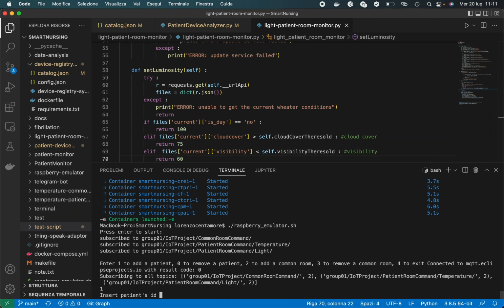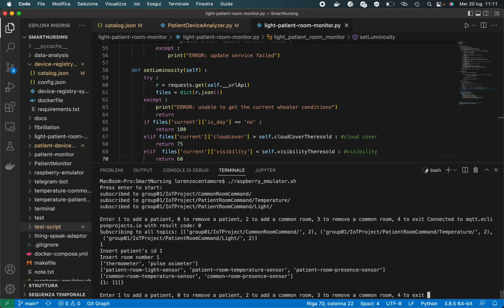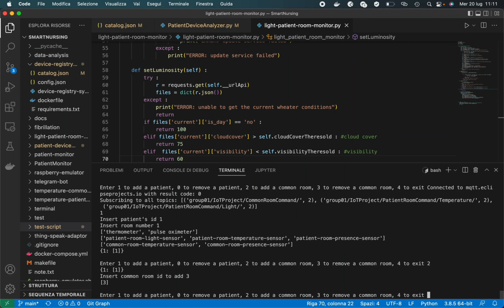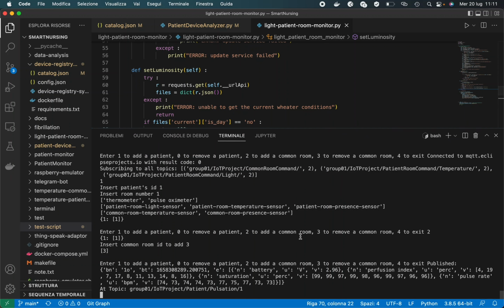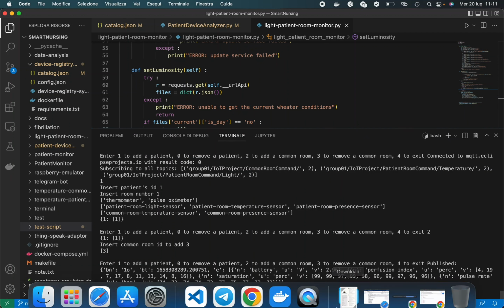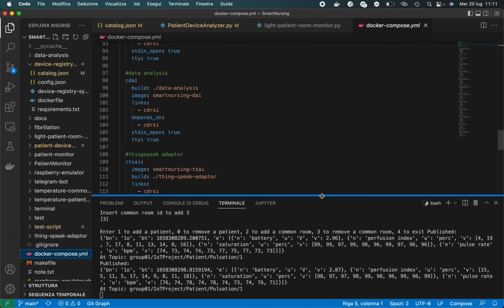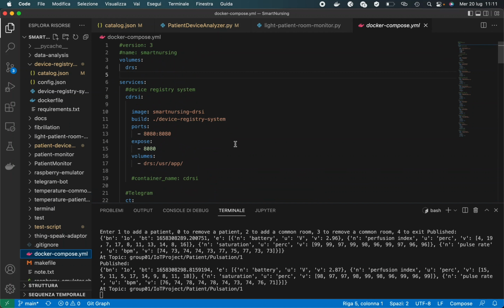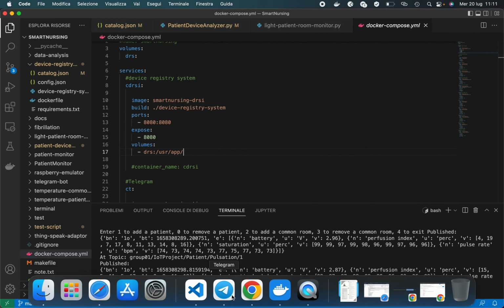Now I will open the terminal of the container of the microservices Raspberry emulator, a microservice that allows generating data for the patients and rooms every n seconds, registering and updating services and devices. In the real case, this corresponds to attaching the sensor to the patient and to the Raspberry and starting collecting data. I will now add patient 1 in room 1. In real life this means plugging the sensor into electricity, generating data for that patient.